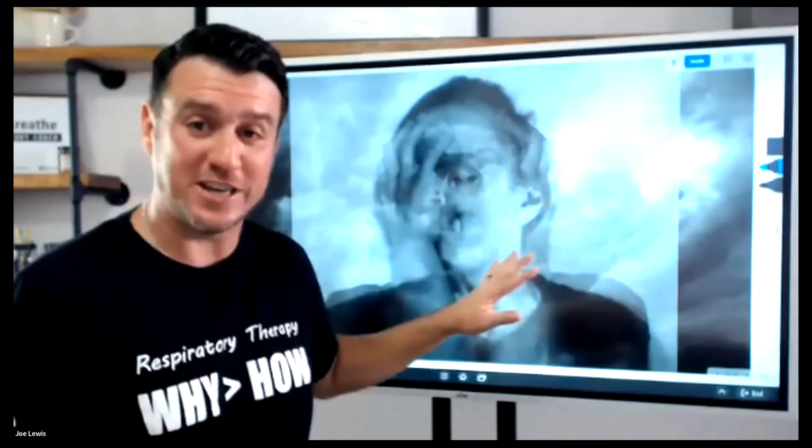If I had to keep going and I didn't have time to be satisfied neurally, then I would just stay short of breath, and I would get more and more and more short of breath. Same thing with your patients. They're going to fight more and more and more the longer they're not neurally satisfied. And so by recognizing that they want a breath faster, maybe they're volume starved and they want just a little bit more volume, all we have to do is help them catch their breath, and then hopefully this will settle down. But they just need some help catching it.